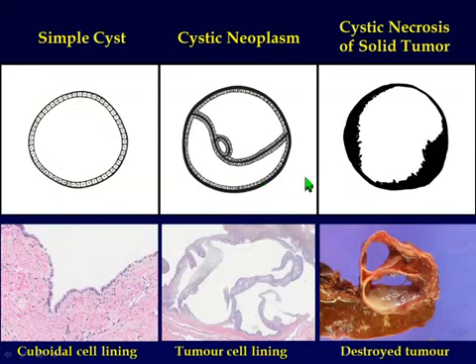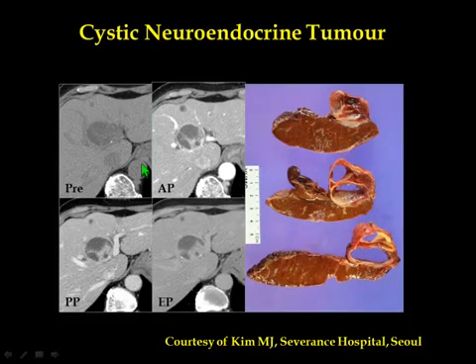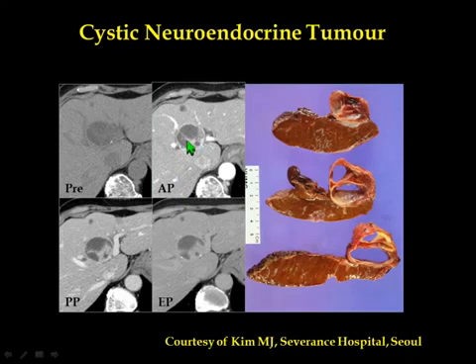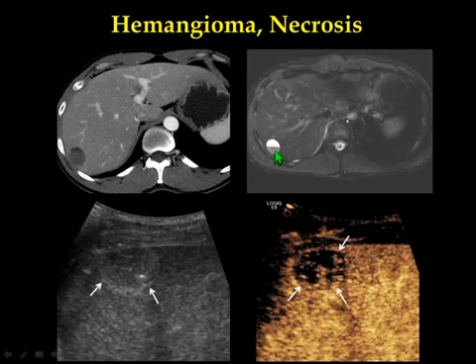Last, let's look at pathology of tumor necrosis — irregular cystic, hemorrhagic or ischemic necrosis — and sometimes there are septa. Here is a case of cystic neuroendocrine tumor. This part was solid tumor but it became necrotic, with remaining septa and hemorrhagic areas. This is a necrotic hemangioma — we thought it was metastasis, perhaps from neuroendocrine tumor — but contrast-enhanced ultrasound shows peripheral nodular enhancement, which is typical of hemangioma.